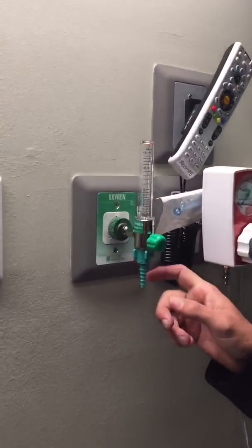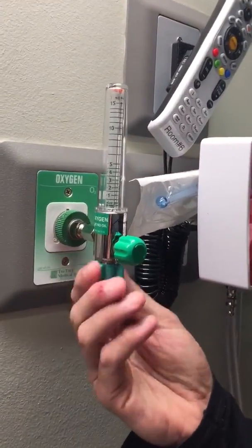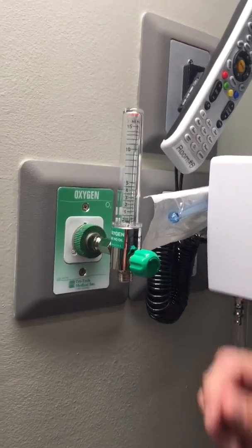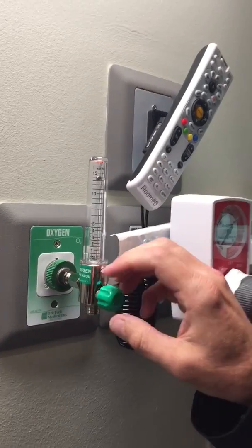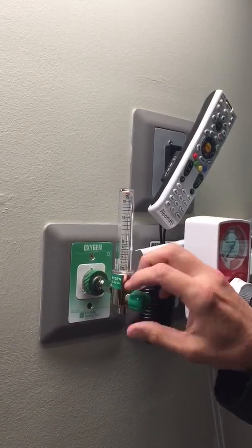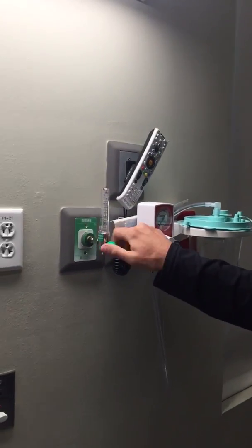We're going to start right here with the oxygen. The two things you need to know: number one, this thing needs to be unscrewed. You'll need to take this off. And second, when you turn the oxygen on you want to turn it on not just to 15, but you want to go all the way — turn it on above 15, open it as much as you can.